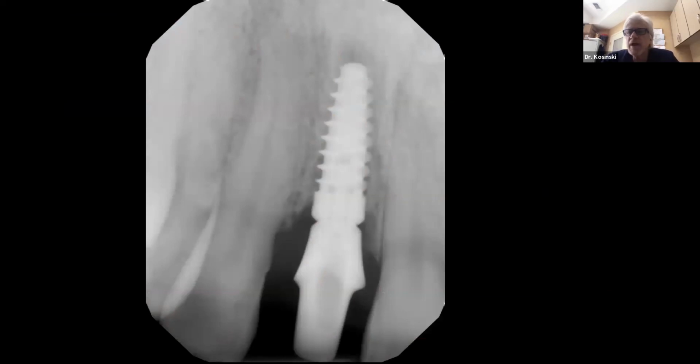And what we're trying to do is trick the body physiologically from bone shrinkage, because it doesn't recognize where the margin is. In the past, we would have an implant, and we would have an abutment that would fit closely, but we would have a micro gap right at the bone level. The body says, I don't like it, and it would resorb to one of the first 3 threads. It's not necessarily the case anymore. And most implant systems are designed with a platform switched prosthetic design.